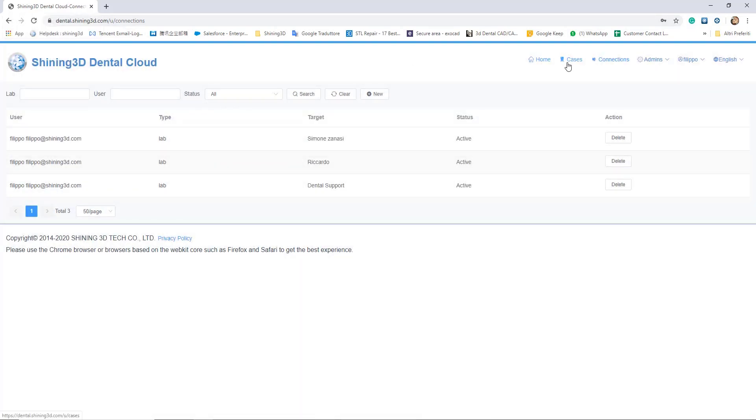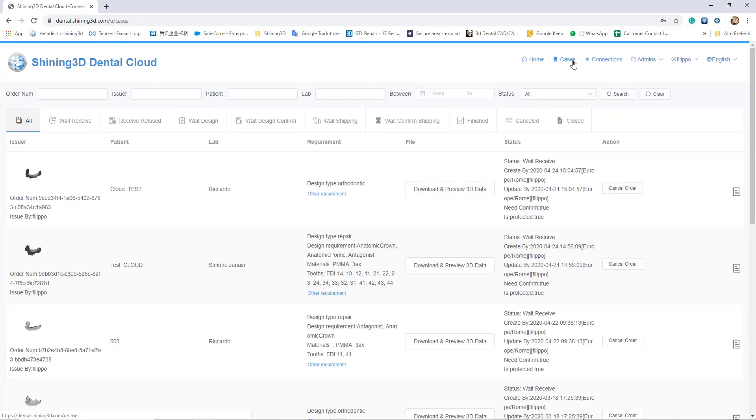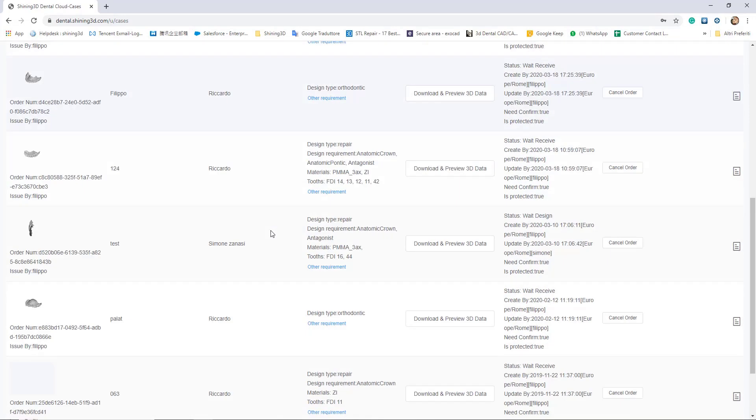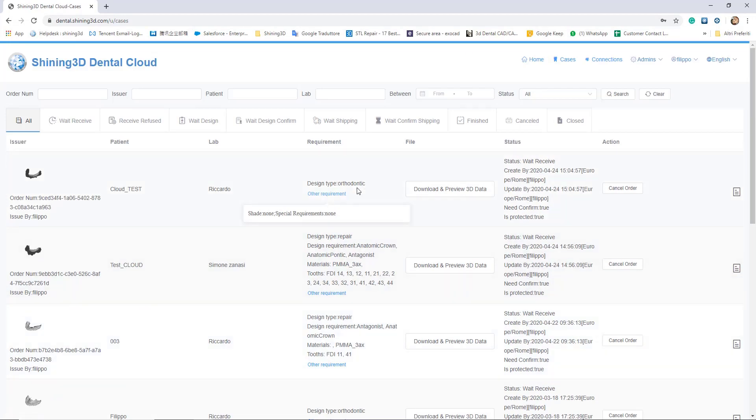Under the cases tab, it's possible to see all the jobs that we upload in the dental cloud, and of course, it's possible to download the files or to preview the data.